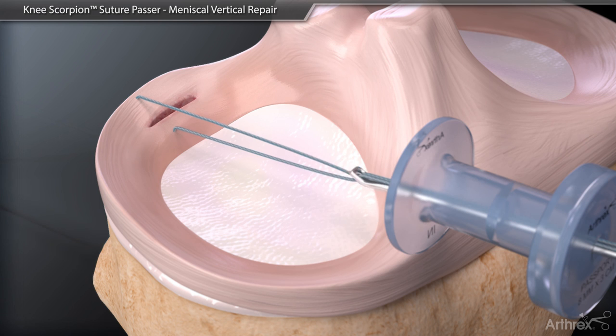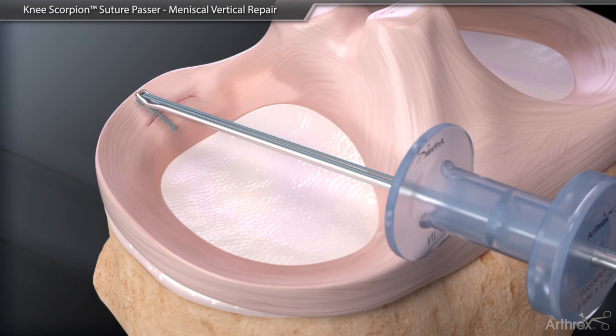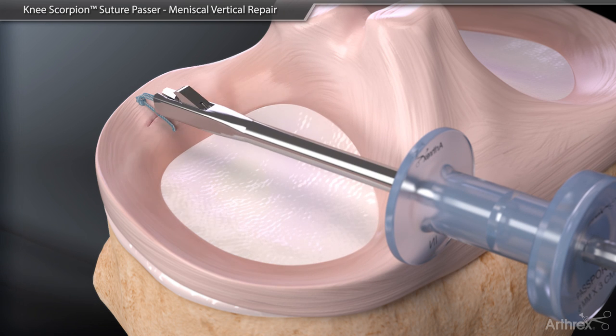Using a knot pusher, it is ideal to push the knot posterior and recessed in tissue. Introduce a suture cutter to sever the suture flush at the knot.